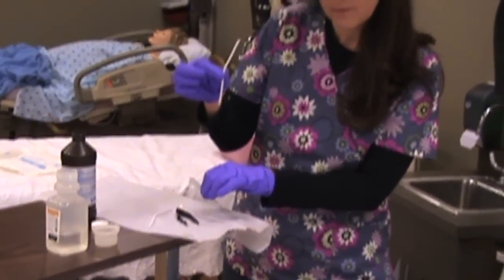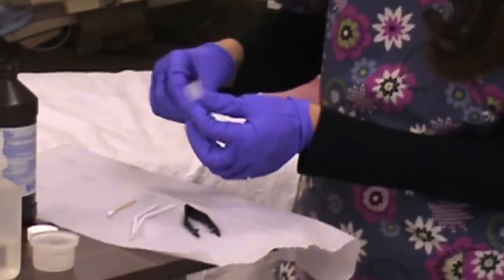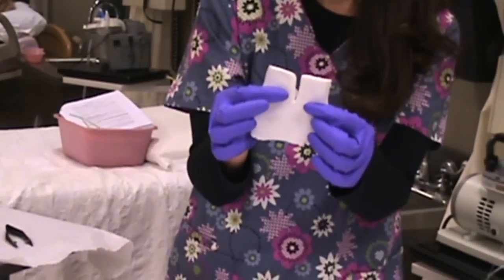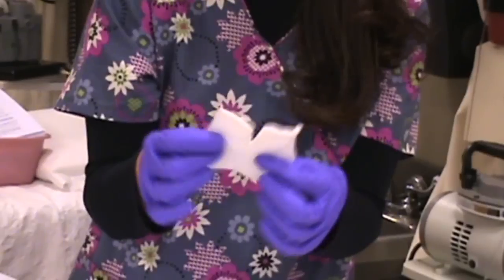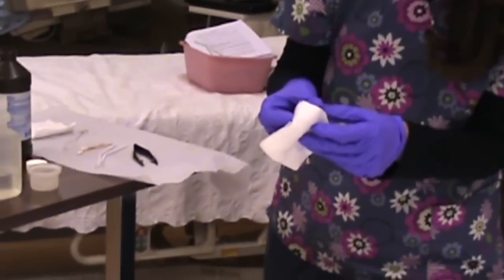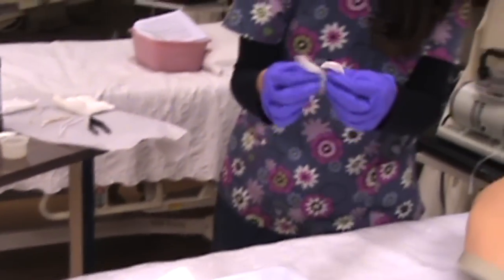I have pipe cleaners to clean the inside of the tubing, and a little brush to clean it, and a couple of Q-tips. This right here is called a drain sponge — you'll also hear it referred to as a slit dressing or a split dressing. And then here are some extra things to clean with.